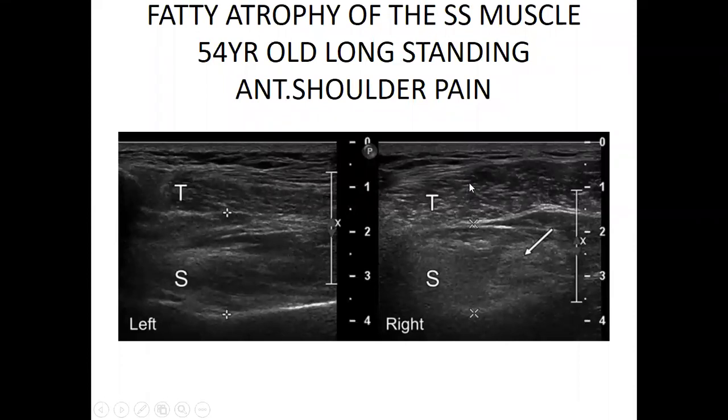You can see even the bulkiness is okay, but once you look at the difference between here and there, you can see there is a difference even within the echogenicity. There is that lesion kind of appearance. But the key issue here is you have to look at the normal striation and any loss of normal muscle composition.